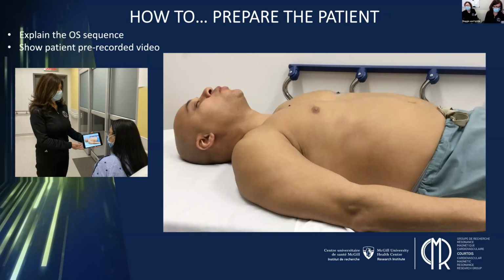How to prepare the patient? It is very important to explain to the patient what the breathing maneuver is. It is a 4-minute sequence where for the first 2 minutes, the patient breathes normally. Then we instruct the patient to breathe in and out deeply and rapidly in sync with the metronome for 1 minute. And finally, it's a breath hold.